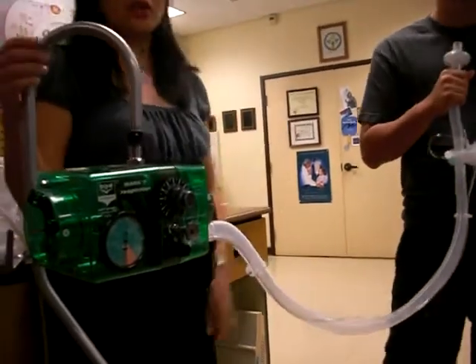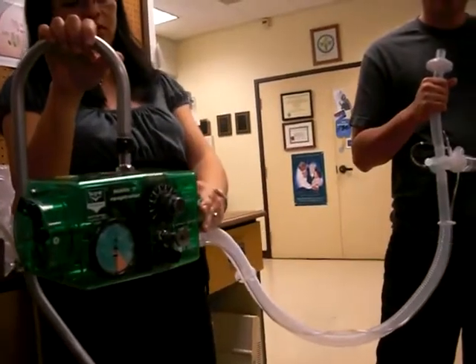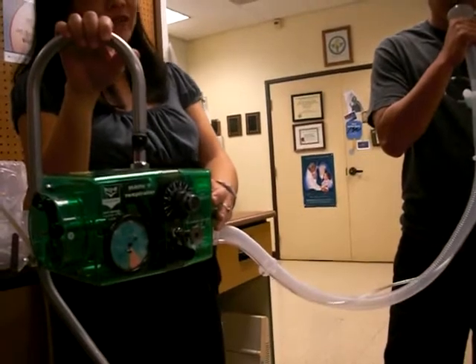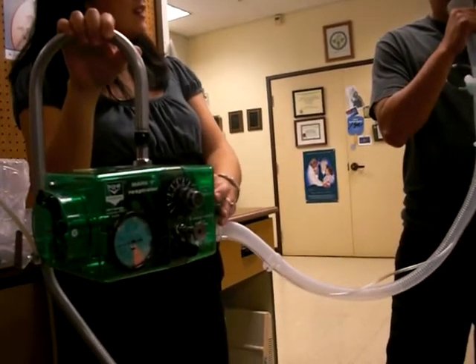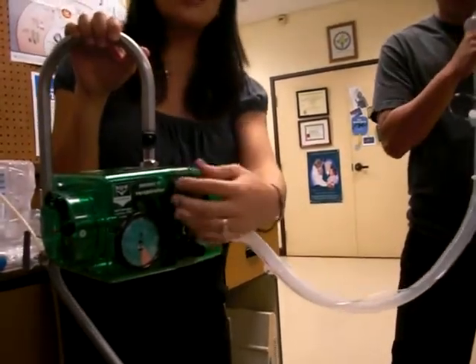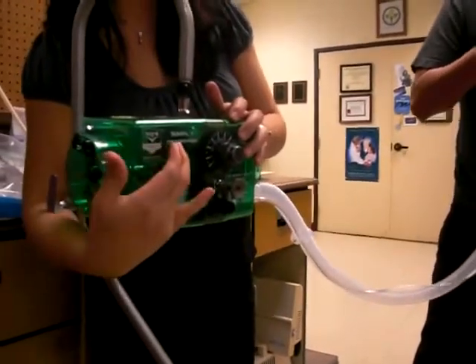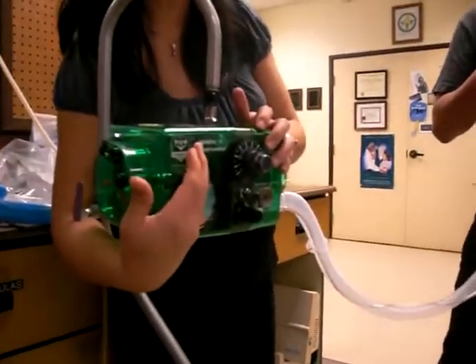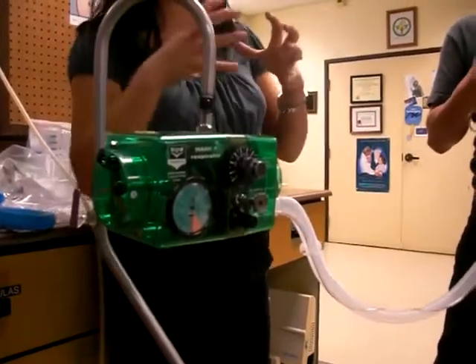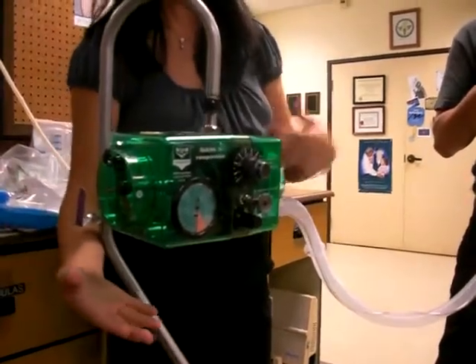Or if the pressure is too high, this is properly set, but this is like blow your lungs up. Okay, take a deep breath. Go ahead, put it in. Really long still. So this is set properly, but it's taking a while for it to hit that pressure because it's so high. Remember, it only stops when it hits the pressure. If that pressure is so high, it will keep going until the lungs are really bloated and filled up before it hits the pressure and it stops. So it's one or the other.